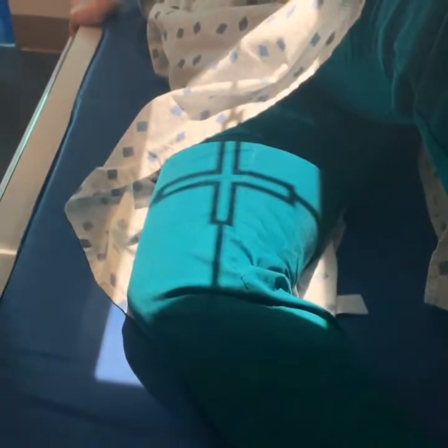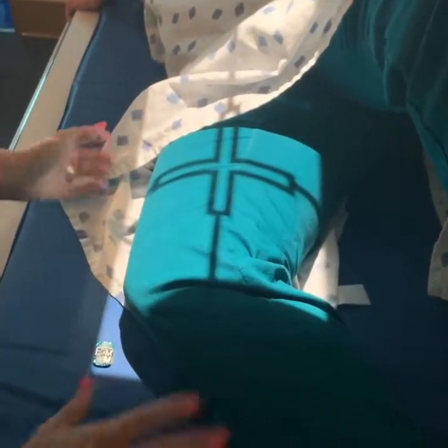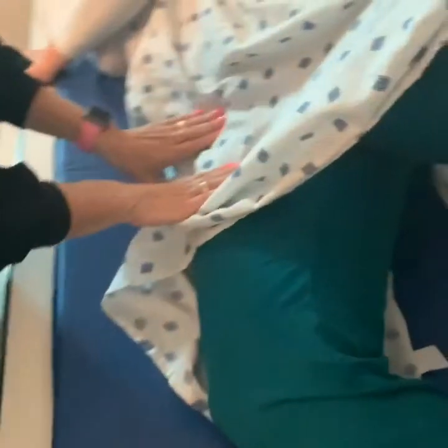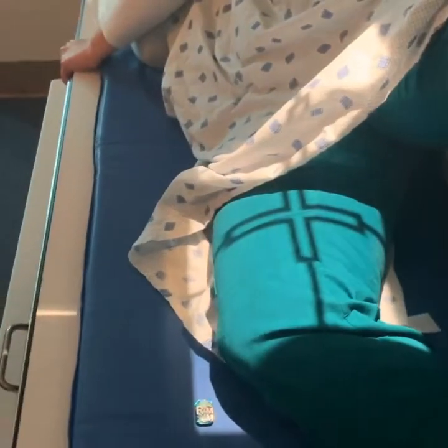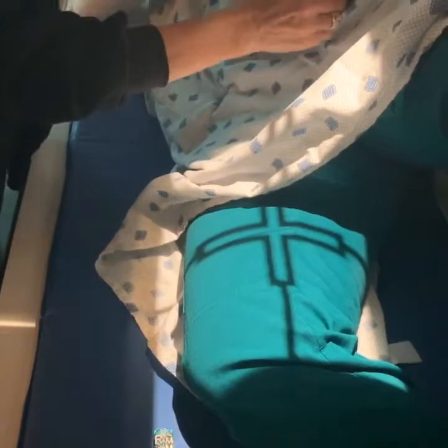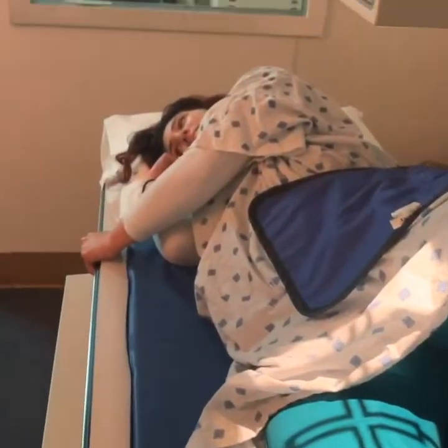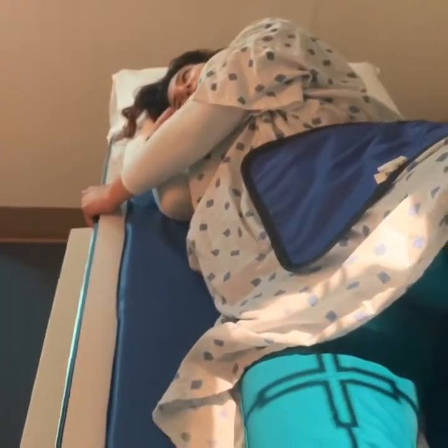Lateral on the leg. I'm gonna put this in the light field. Good, just like that. And I'm coming all the way up here. Now, ASIS is here, so I know that I have that in the light field, plus the IR is coming to about here, so there's no way I don't have overlap on that. Just like that, I'm gonna have you hold still one more time. Put this on me like that. All right, right like that. One more time, stop breathing for me. Beat, good, breathe and relax.